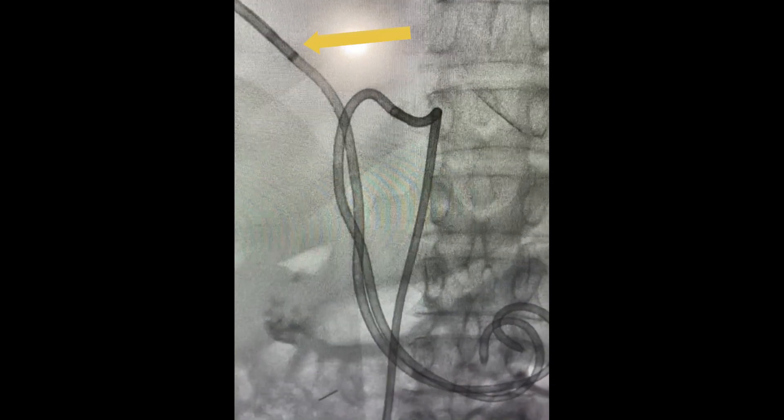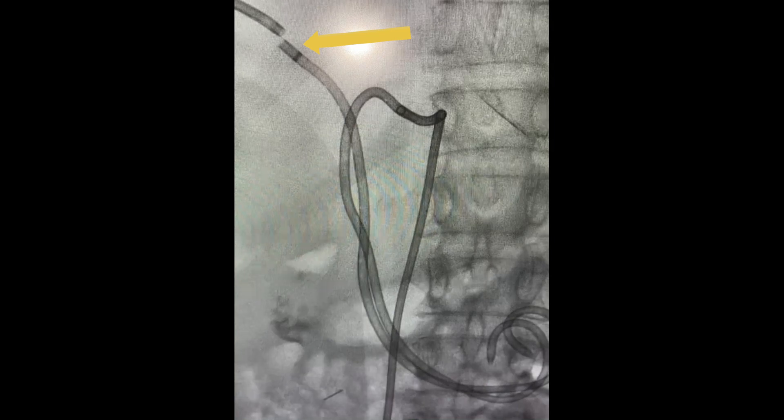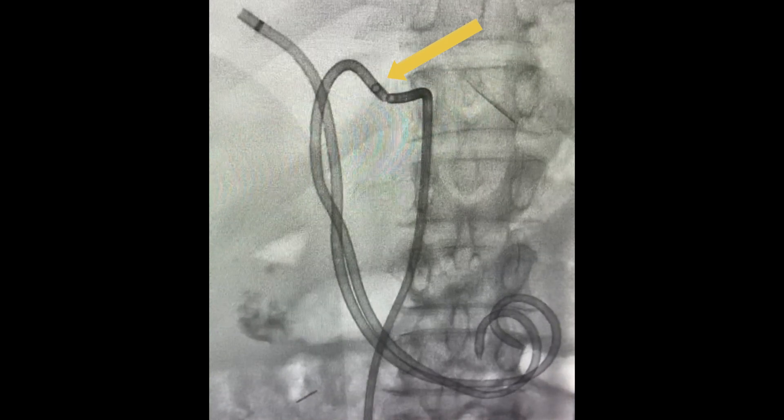This is an example of a bilateral biliary case, where we are removing the external portion. We were comfortable with our internal patency, so we are actually converting to a stent at the time of placement.